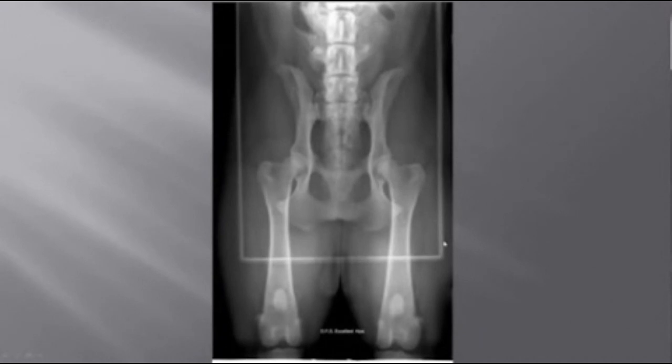I'm going to start with this dog that had an excellent set of hips — really a pretty set. The femurs, these long bones that go from the pelvis to the knee, are almost perfectly parallel. The kneecaps, these little round things that look like beans, are very close to being in the middle of the bone. The pelvis is level — the obturator foramen are very close to being the same size. So the legs are parallel, the kneecaps are in the middle, and the pelvis is close to being flat. We get an excellent OFA grade.